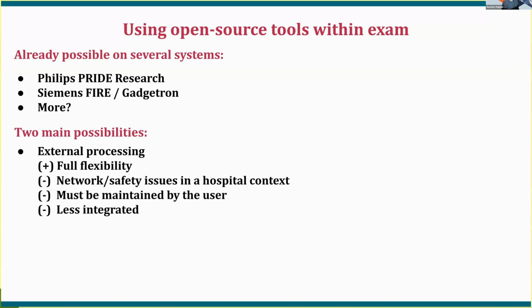Here, I just wanted to make a small digression. I think there are two main possibilities to make a tool available. Here we chose the open source approach, which requires it to be kind of external. It's very flexible because then it's open and we can do whatever we want, but you need to have a separate machine to do that, which you have to maintain, which you have to integrate in the hospital network, which is maybe the main issue for us sometimes.